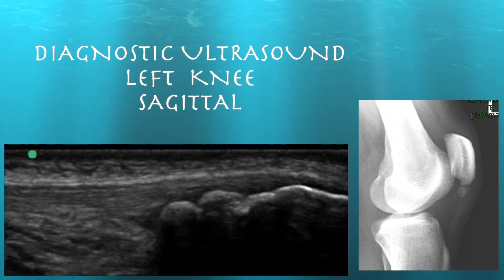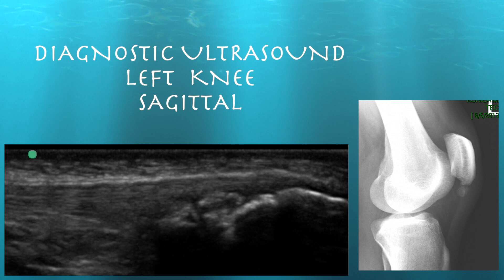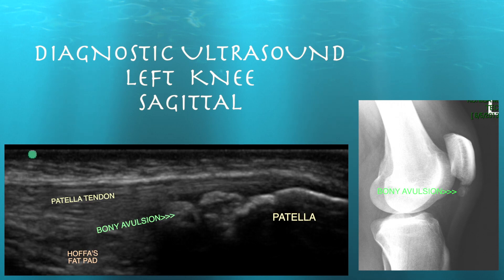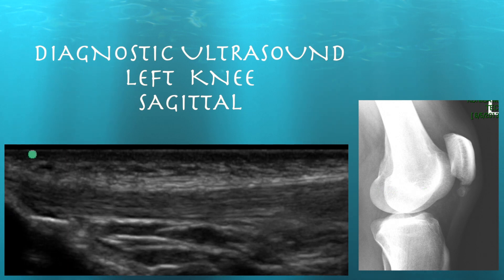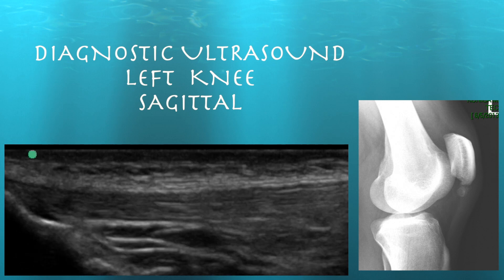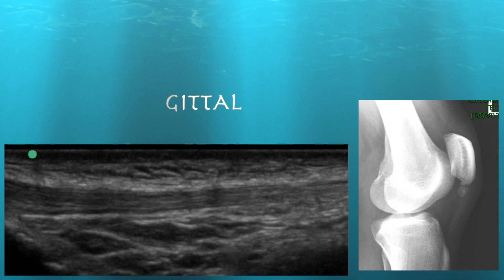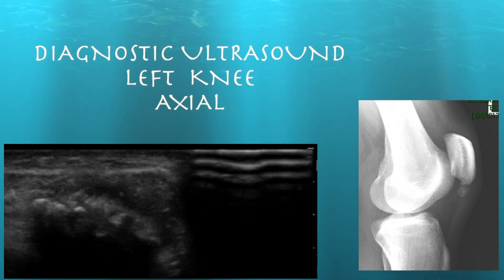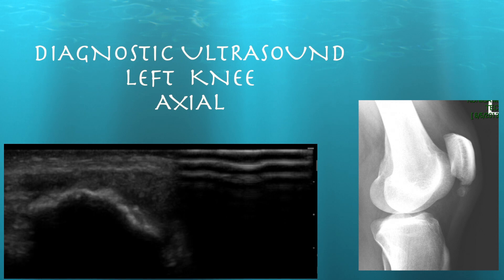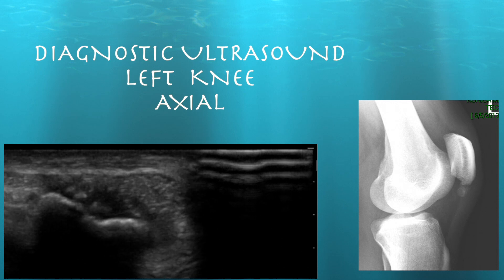Looking at his left knee, you can see some calcification both on the ultrasound and the X-ray in the proximal patella tendon near the patella. You could call this a bony avulsion, or it may just be calcification of a degenerative type of tendon. The distal aspect of the tendon going into the tibial tubercle looks essentially preserved. On axial views, you can see the patella with those calcifications just inferior to the patella, which could certainly be avulsions of the inferior patella.